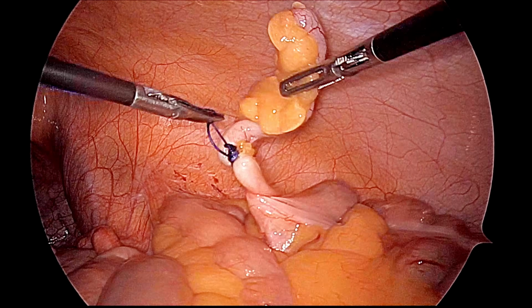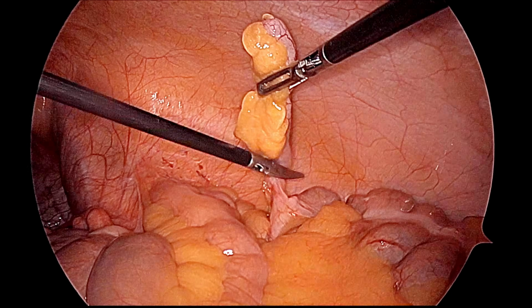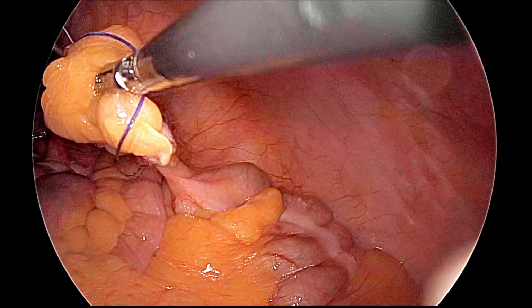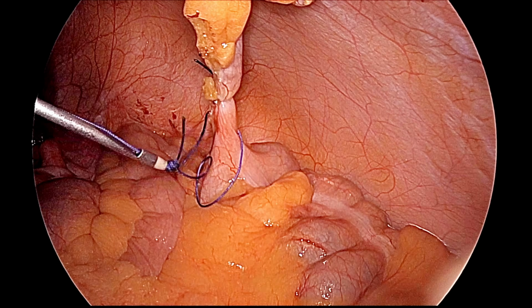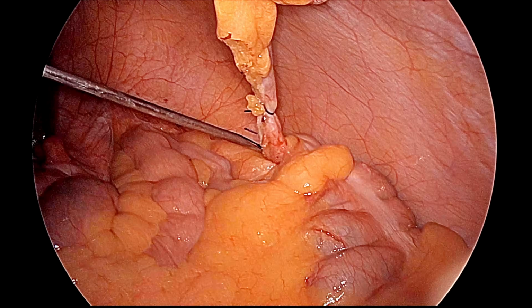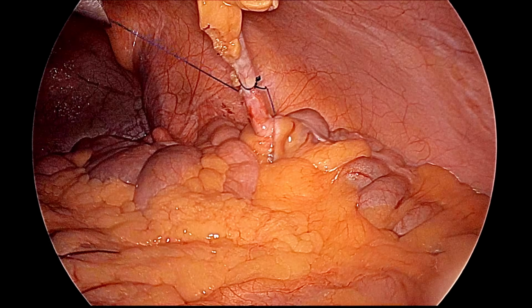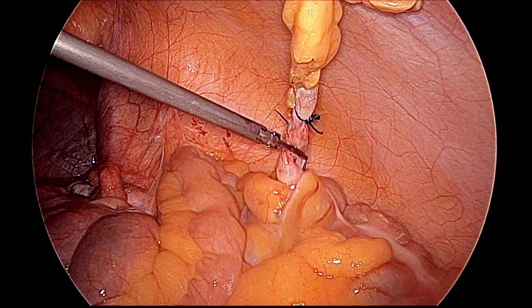But we can see this knot is not up to the base, so we will use a second knot also, and that will be on the base of the appendix. The second knot must go up to the junction of the appendix with the cecum. For that you should keep the tip of the Van Darker knot pusher over the cecum, so that you take the complete appendix, and it is not an incomplete appendectomy. So this is the second knot applied over the base, and after that the appendix will be detached from the cecum.